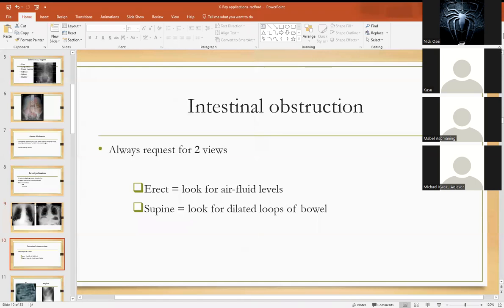The other thing we can see is in the setting of intestinal obstruction. Someone presenting with absolute constipation for about three or four days, with a distended abdomen — you do the abdominal X-ray. What you need to know for abdominal X-rays is that you always do erect and supine. On the erect, where the patient is standing, you see air fluid levels — the dilated loops of bowel show fluid settling with air above it. On the supine, where the patient is lying flat, you see the dilated loops of bowel.